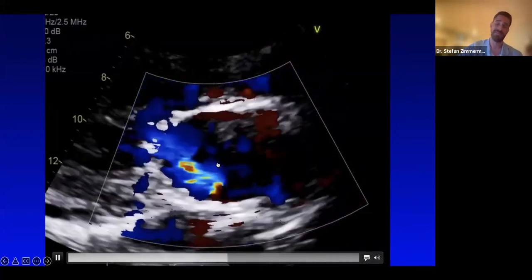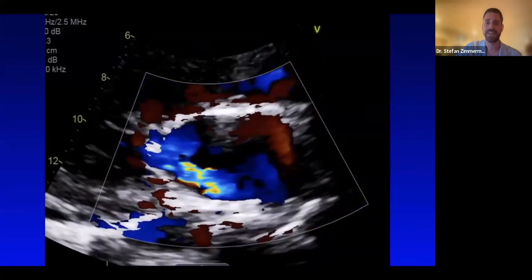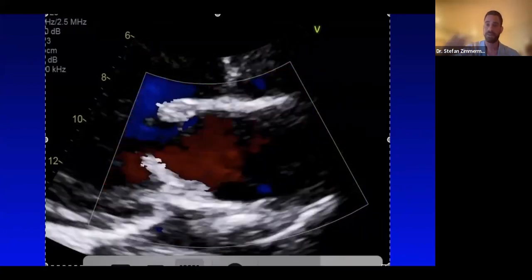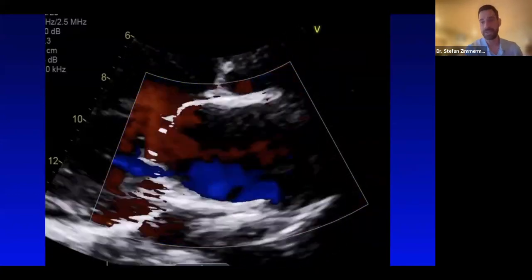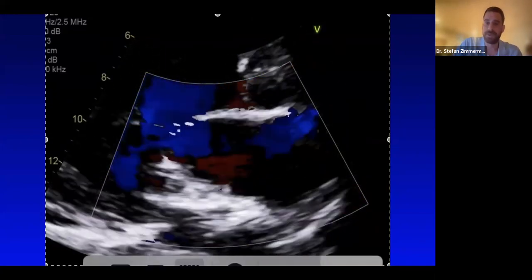Now, if you haven't really looked at these, it's really tough to tell what's going on. It just looks like a blur, a big mess. But trust me, this is showing mitral regurgitation. And from this, you can grade the severity of regurgitation. You can determine whether or not the regurgitation needs to be fixed, follow the regurgitation over time, and so on.